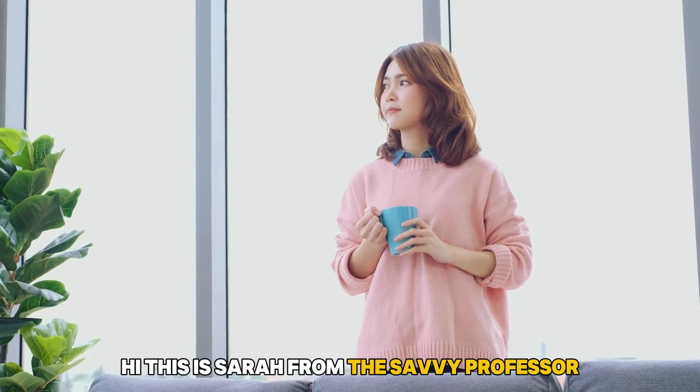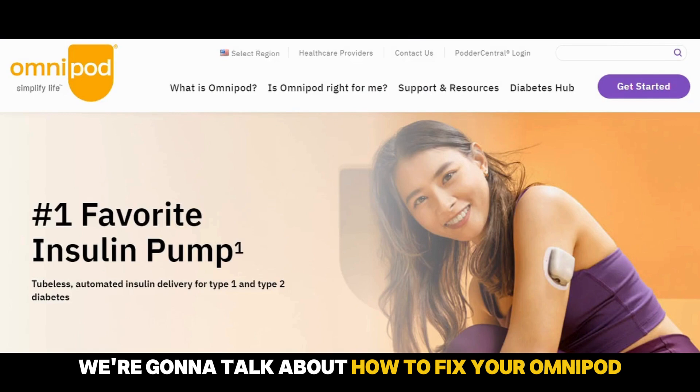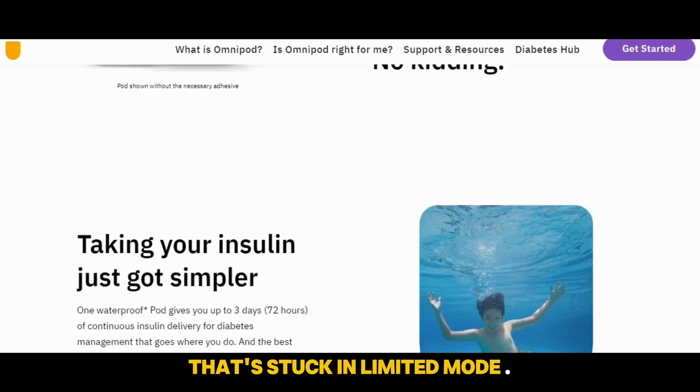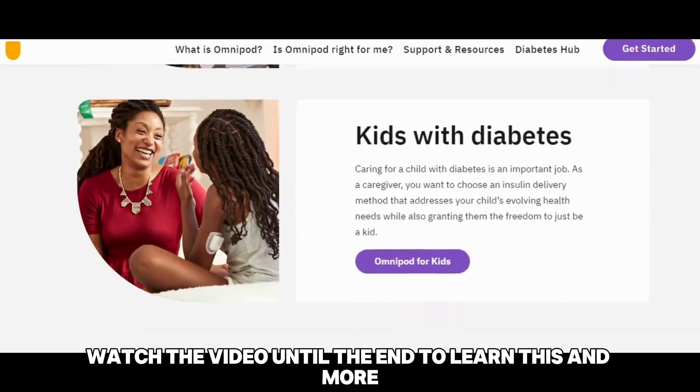Hi, this is Sarah from The Savvy Professor, and in today's video we are going to talk about how to fix your Omnipod that's stuck in limited mode. Watch the video until the end to learn this and more.